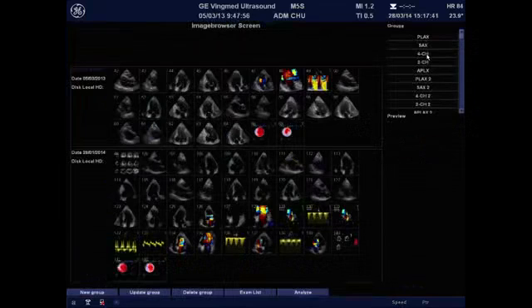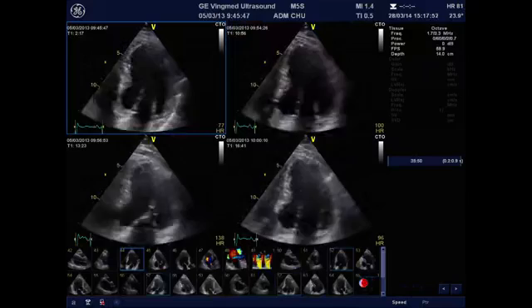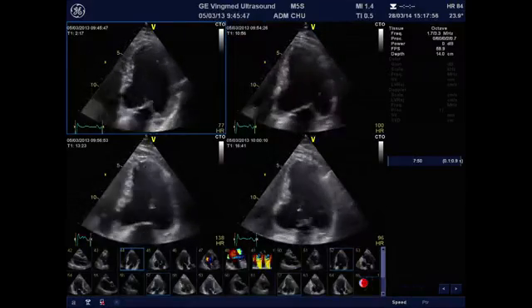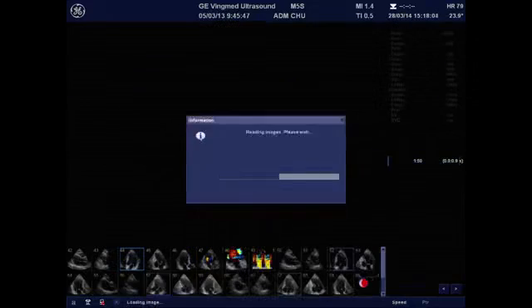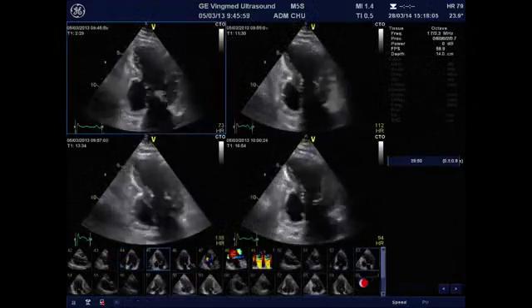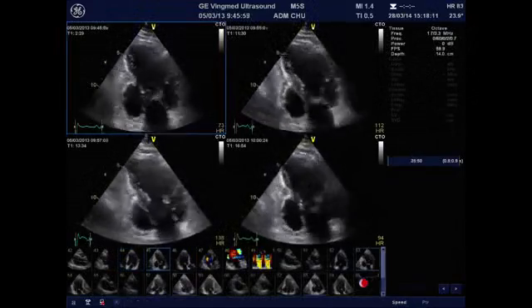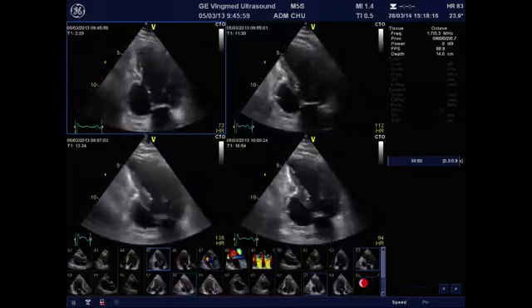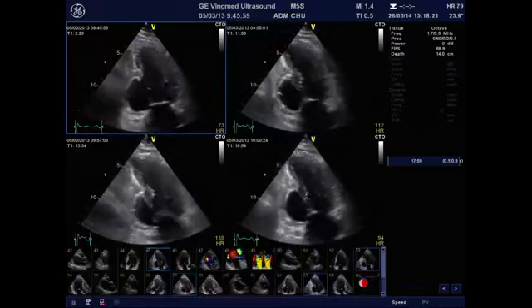We take the 4-chamber view. Again, there is clearly abnormal thickening at the apical region of the septum as compared with rest and low charge. We continue with the apical 2-chamber view. Well, clearly there is no improvement at the level of the transmural infarct, and it seems that the anterior wall is less contractile at peak exercise as compared with low charge of exercise.